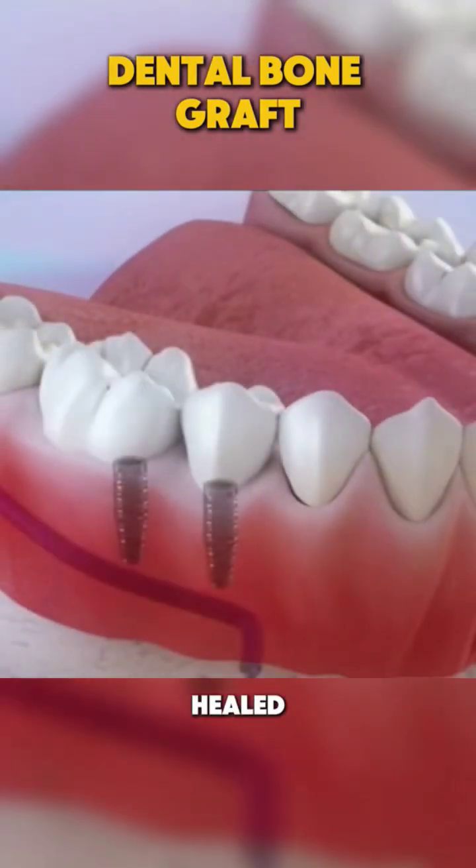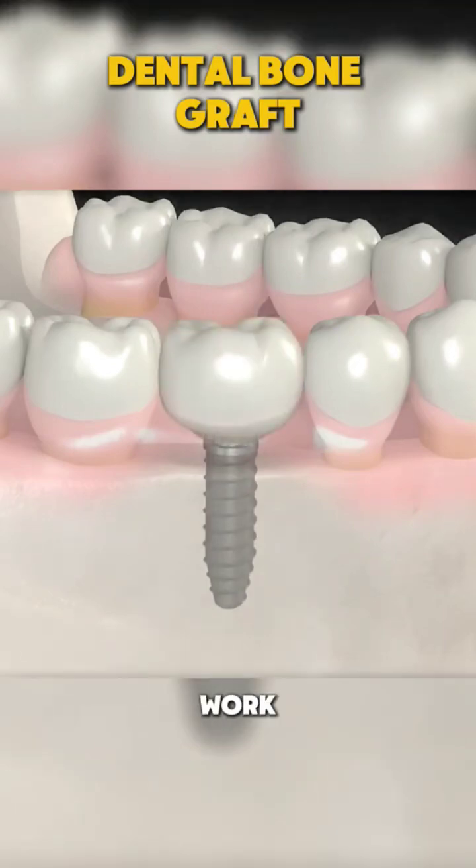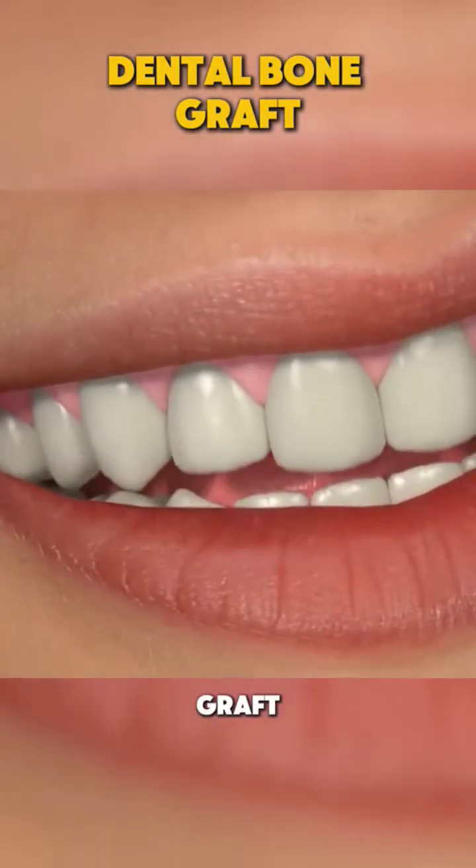Once healed, the area will be ready for a dental implant or other restorative work, and that's how a dental bone graft is performed.